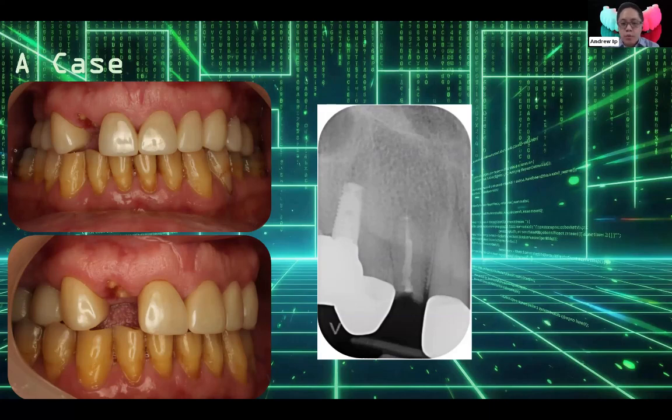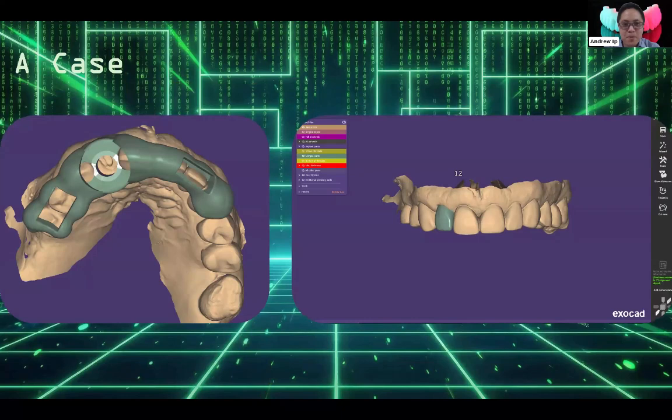What we were going to plan to do is take out the tooth, place the implant, take a mid-procedure intraoral scan, design the restoration, and fit it, all in the one appointment. Okay, so here, this is the initial PA. Oh, sorry, if you hear my cat meowing in the background, that's Minnie.